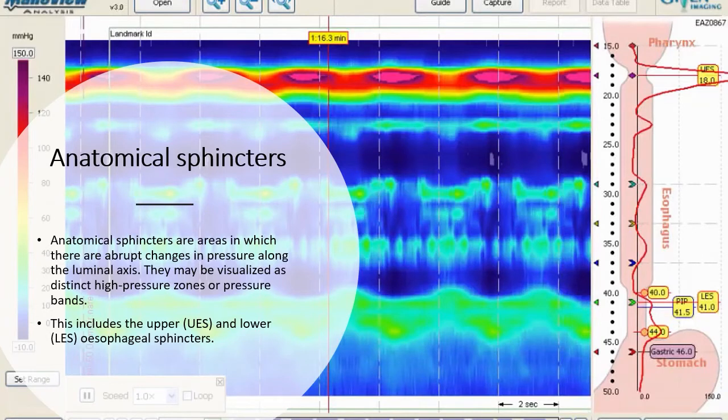Anatomical sphincters are areas in which there are abrupt changes in pressure along the luminal axis. They may be visualized as distinct high pressure zones or pressure bands. This includes the upper and the lower esophageal sphincters.